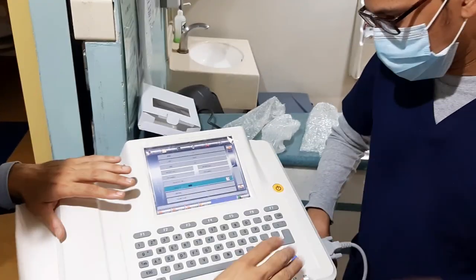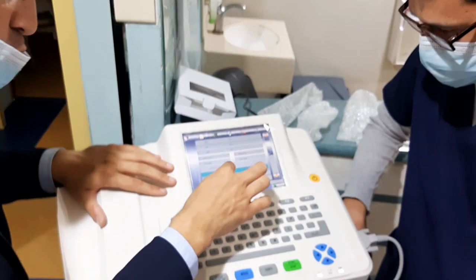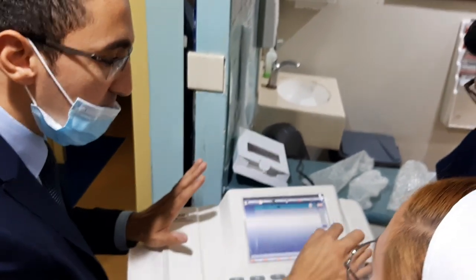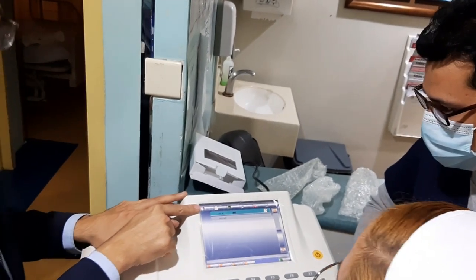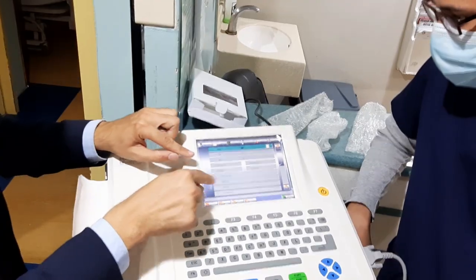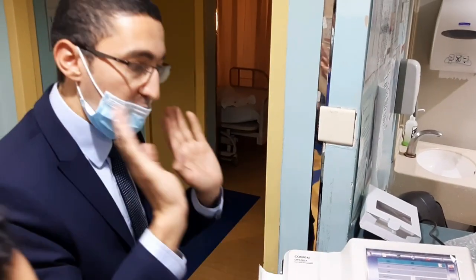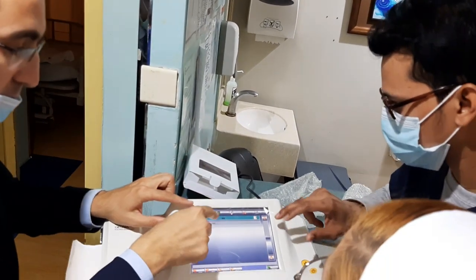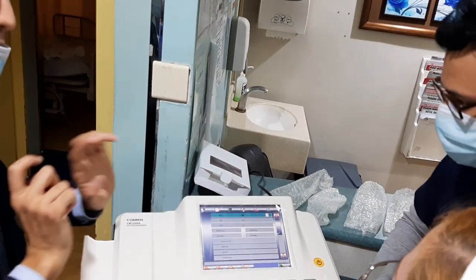You will enter hospital name and this OSH, okay? Doctor, if you want to enter, okay? A technician, if you want to enter. This one is extra information. Bed number also, if you want to enter, okay? But no need, you can enter hospital number, so this is a file number. Yeah, this is a file number of the page. This page number two, go here, so page number one.